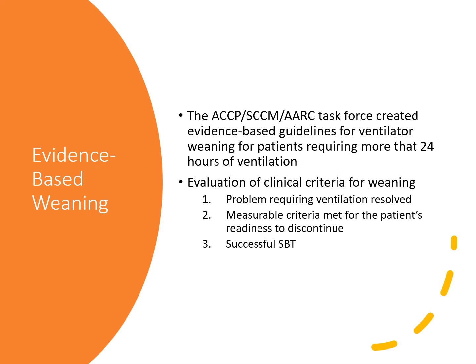So the challenge of successfully getting someone off a ventilator has been very debatable. There's a lot of solid evidence to identify the readiness to wean, and there's a lot of people that really continue to look at the different ways of trying to make sure the patients are safe and ready. Are we doing too many criteria, too little criteria? What research do we need to continue to do? So there's a lot of debate that you're going to see out there.